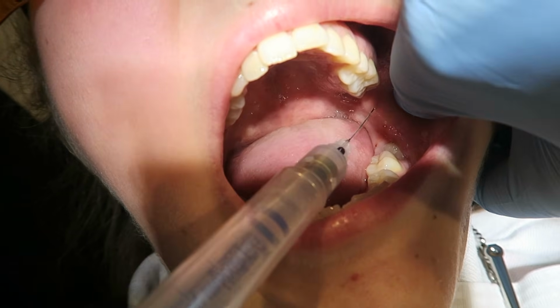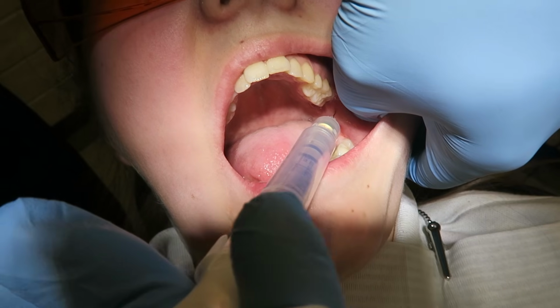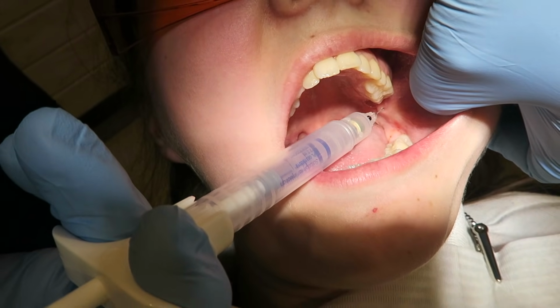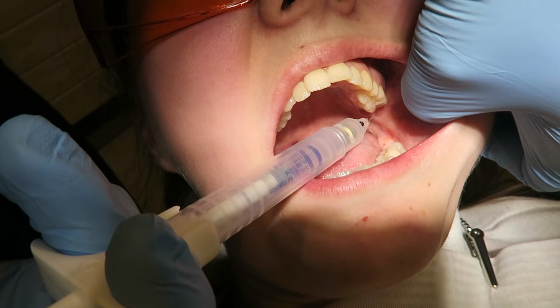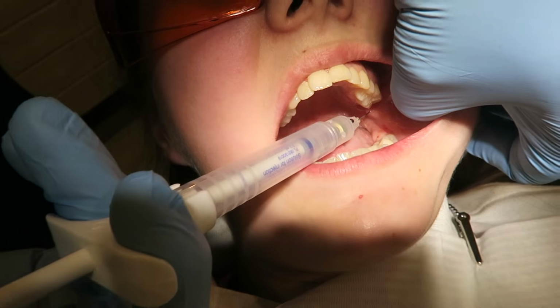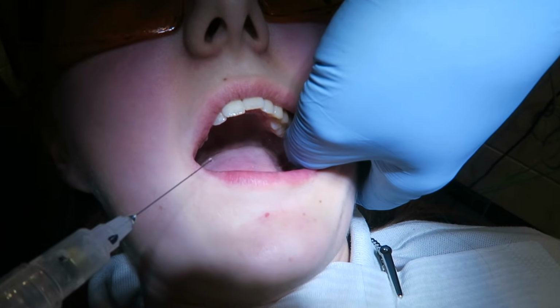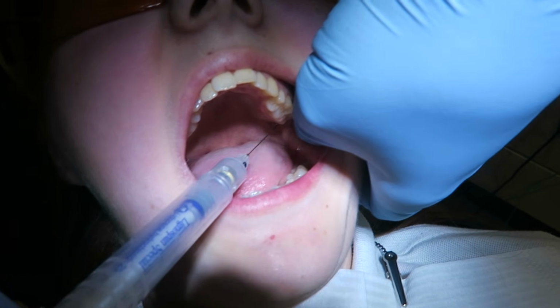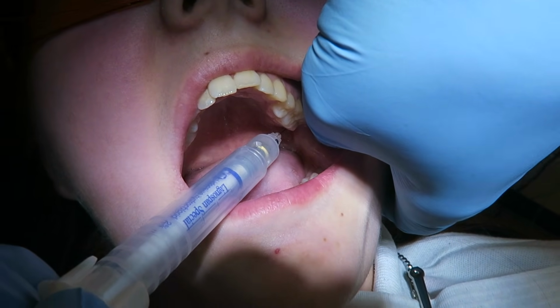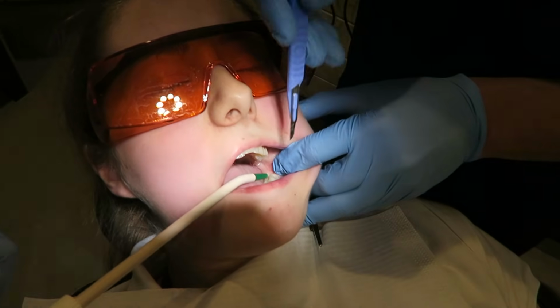I go slightly higher. This is a good trick for you to learn. If you fail your anesthesia, go back again and go slightly higher, and then inject slowly again for the ID nerve. Okay, so I've given 2 local anesthetic using xylocaine for the ID nerve and the lingual nerve. I'm giving another injection again just to show you how high you can go in case you fail to numb up the ID nerve.